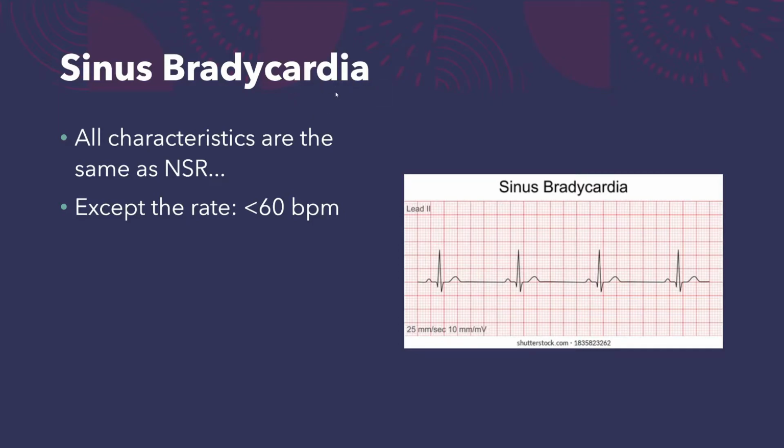Sinus bradycardia is not necessarily a bad thing. It could just mean that someone is highly trained. If they were bradycardic because the P waves were gone, well, that would be a big problem. That would mean the SA node is damaged, and now maybe the AV node is pacing the heart. That would explain a slower heart rate, and that would be a problem that you would need medical attention for. Sinus bradycardia is not necessarily bad. It could also be that they're on digoxin or some other medication that lowers their heart rate. So not necessarily an emergency.